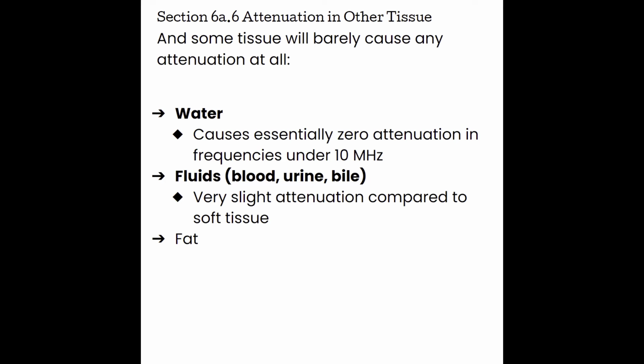For example, in the abdomen, with all the bowel and air circulating around, going directly over the intestines causes a lot of attenuation, causes a lot of problems for seeing structures that sit behind the intestines. In echocardiography, if somebody has a lung that kind of flops over everything, it makes it really difficult to see the heart because the lung is scattering so much of our ultrasound information. So by changing windows, angling around high attenuation structures, or using structures like a full bladder to help us visualize, ends up being very critical in our decision-making process and how to obtain diagnostic images.